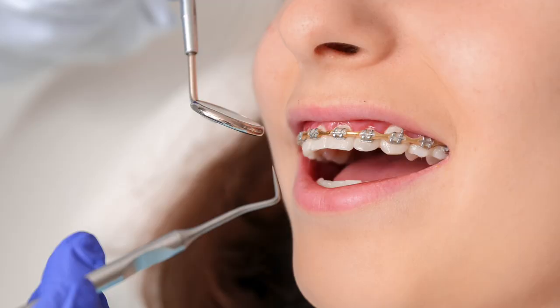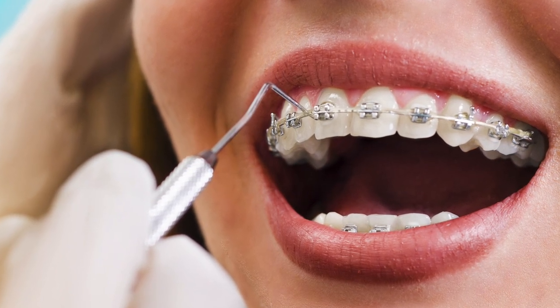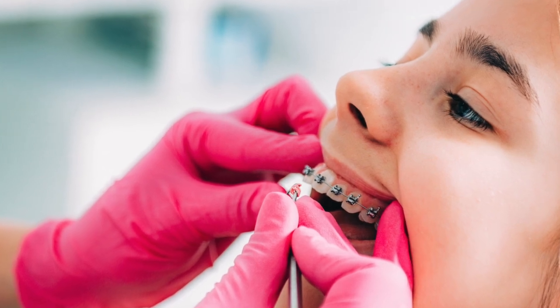If none of those items apply to you, it's possible the broken bracket was caused by something that happened during the bonding process at the orthodontic office. A few things that could cause a weaker bond include: the teeth getting wet during bonding, since any amount of saliva on the teeth can weaken the bond and it can be difficult to keep all the teeth dry; the teeth not being totally clean, as any amount of plaque, food, or tartar can weaken the bond; and the bracket getting bumped or moved during bonding, which is especially common with young children who have a hard time sitting still.